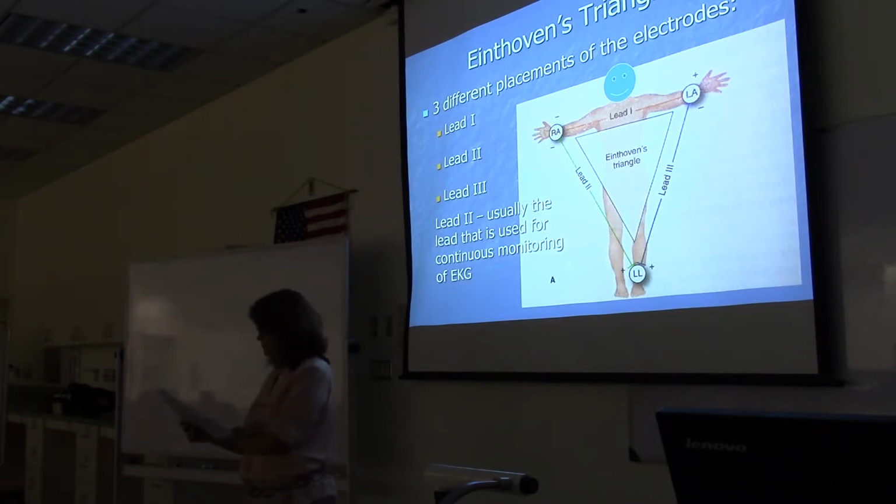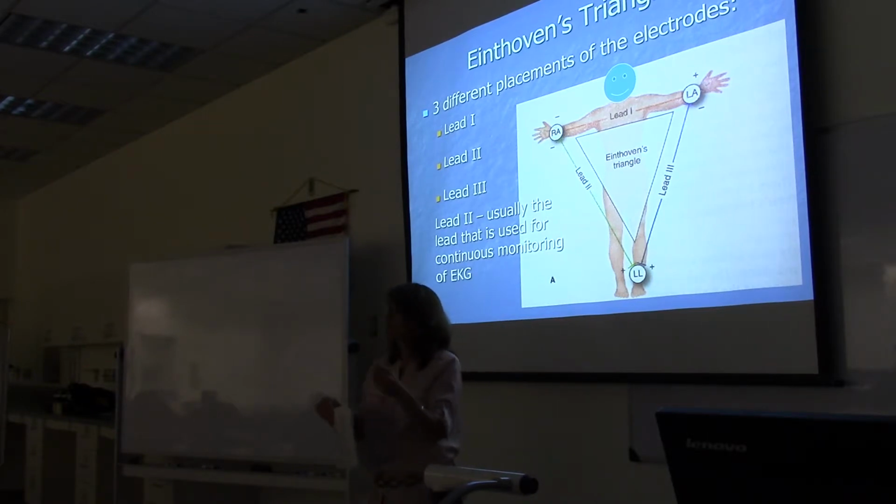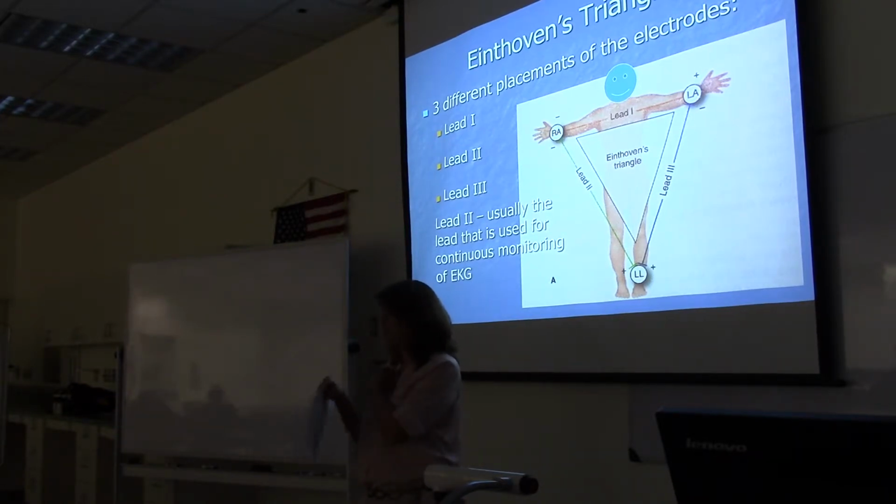So essentially, can that cause contraction? No, we're just monitoring something. We're sensing heart depolarization and repolarization. Right. And we're starting off saying that the one on the right is positive, but we can tell the machine, make that the negative one, and make this one positive instead of the ground. Oh, okay. So you could change them. Yes. Okay, I see what you're saying.